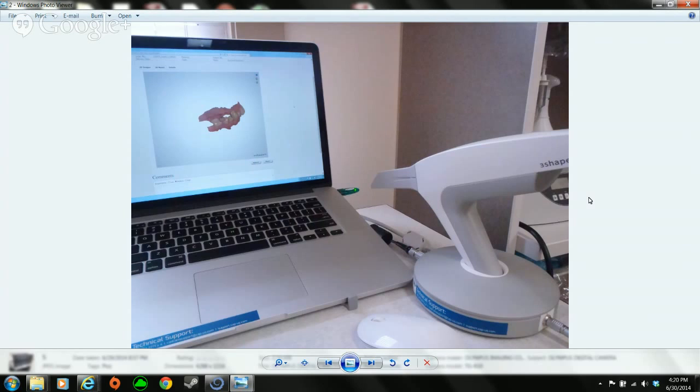What we'll do is a wax try-in of ideal tooth placement. I'll duplicate that wax try-in out of acrylic like Jet, and we will scan the patient with that Jet with barium markers in place, and then I'll scan the scan appliance with the CT machine by itself, merge the two together in Blue Sky, and do the exact same protocol.